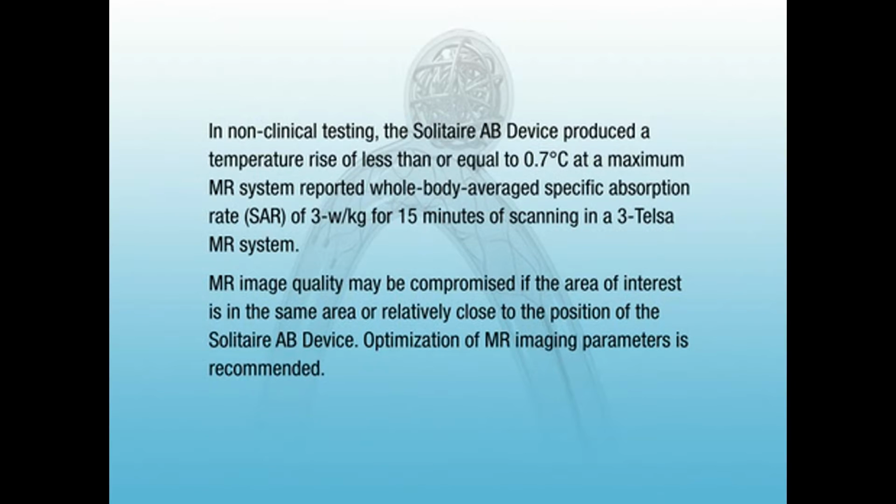MR image quality may be compromised if the area of interest is in the same area or relatively close to the position of the Solitaire AB device. Optimization of MR imaging parameters is recommended.